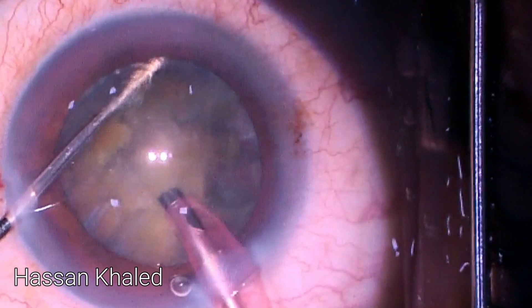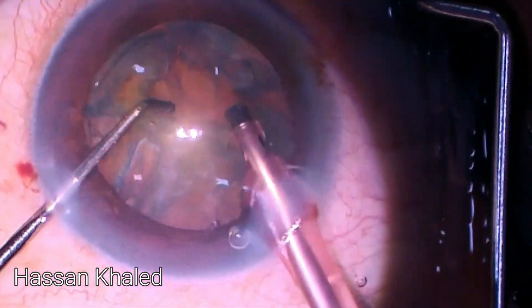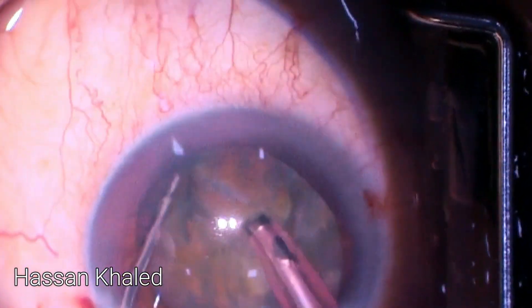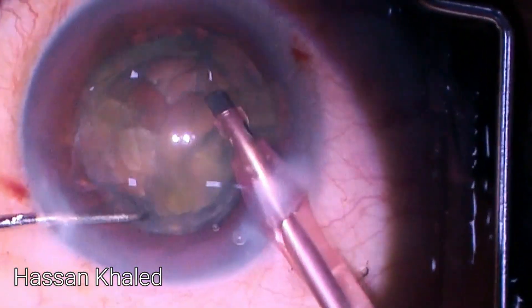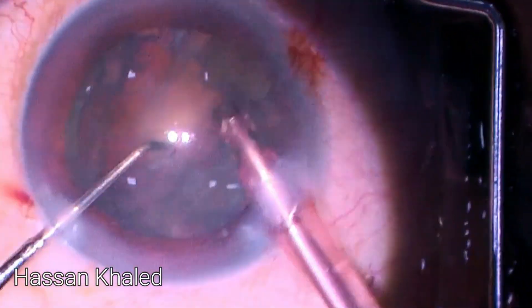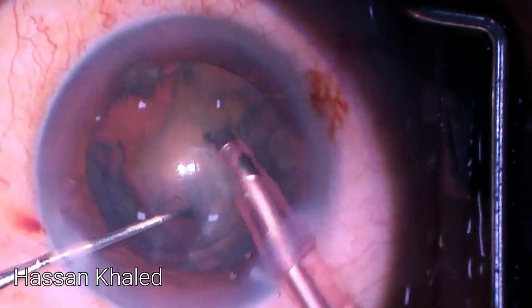Each piece is emulsified individually at the level of the pupil or just subnuclear, as is clear here. This is the end of emulsifying this dense nucleus. There is still an epinuclear shell and cortical shell — now it's time for cortex removal.